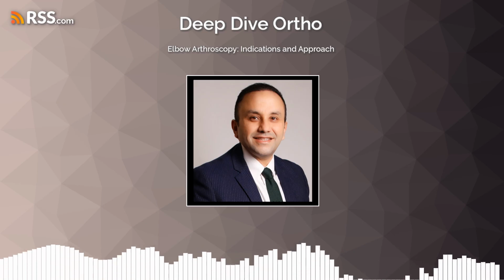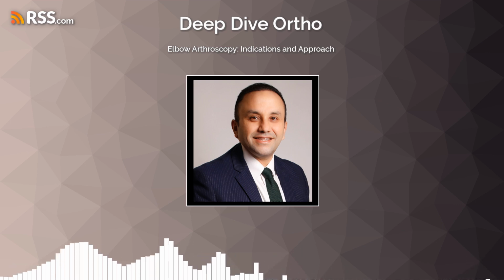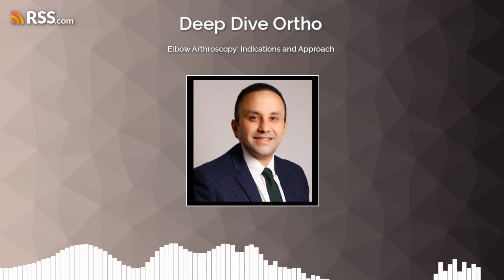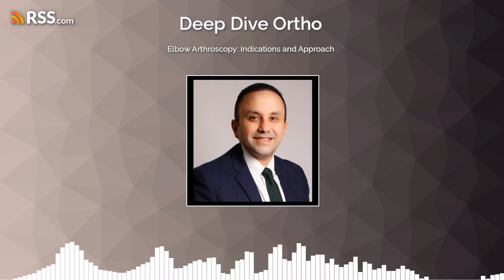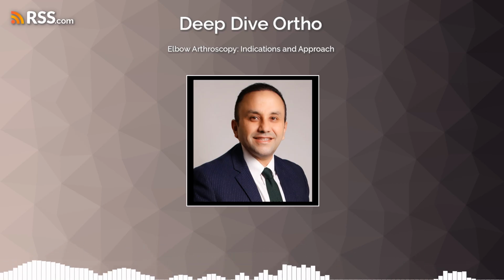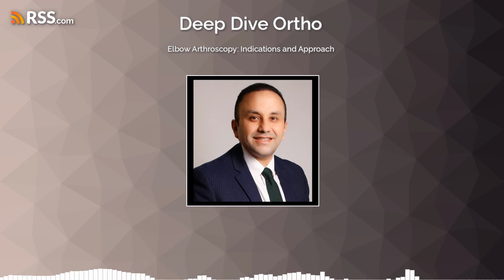That's a great question. And yes, for OCD lesions with significant bone loss, bone grafting can indeed be performed arthroscopically. This often involves placing the arthroscope in a posterior lateral portal, advancing it down the lateral gutter, and using that 70-degree scope to get a direct, clear view of the capitulum. We can then insert allograft cancellous bone plugs, typically 1 to 2 millimeters smaller than the defect, to fill the void and help reestablish the normal convexity of the capitulum. These can sometimes be covered with a biologic patch or cartilage graft to further promote robust healing.